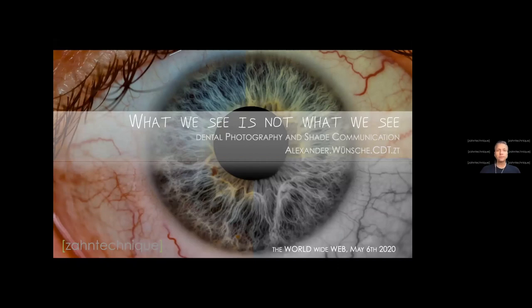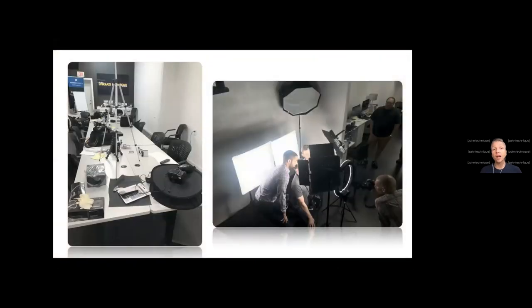Moving forward with dental photography, we see a lot of materials. This is one of our hands-on workshops we did here in the laboratory in Miami. On the left side you see total chaos — all these different devices laying around, and that's how photography is. We have so much stuff we may or may not need. The question is always: how much do I have to invest in good equipment to actually do dental photography?